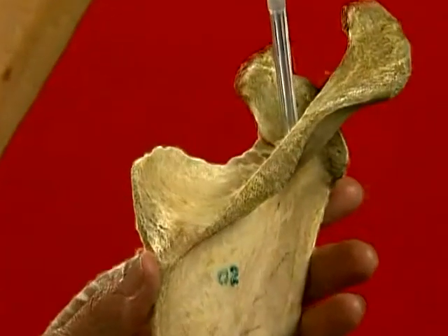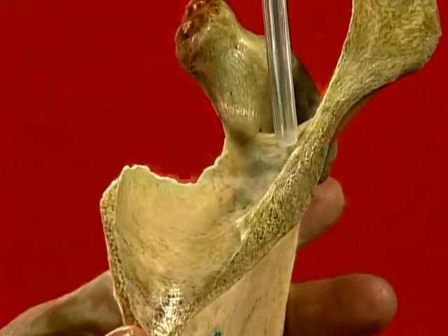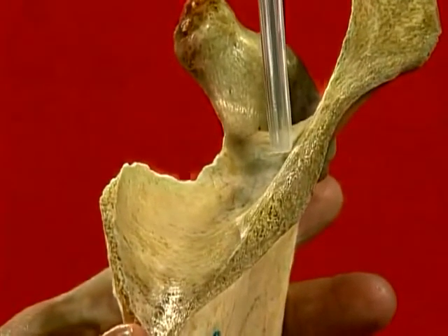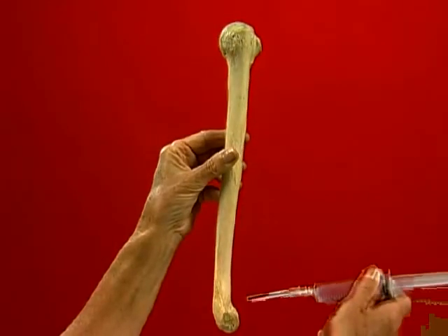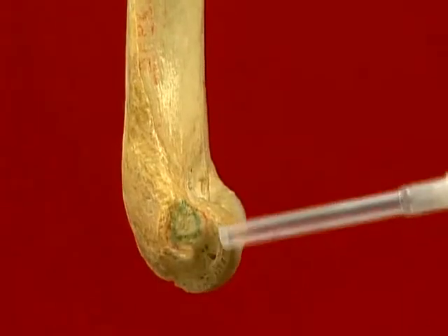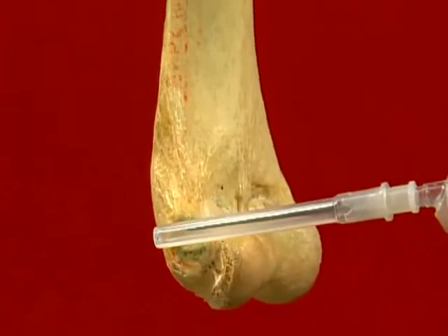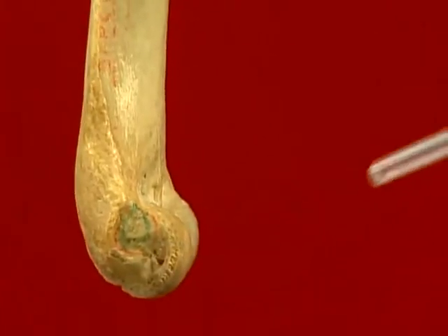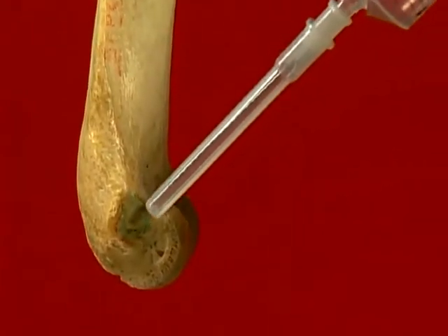The suprascapular nerve lies in the fossa, and the needle point must touch bone before injecting. The tendon arises from the facet immediately in front of the lateral epicondyle. The needle is inserted just anterior to this point, moving down to touch the facet and pepper the solution at the tendon enthesis.